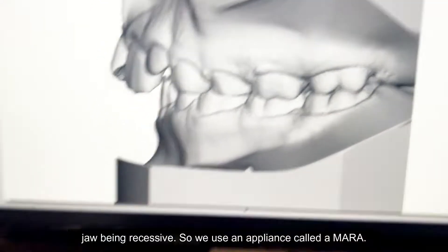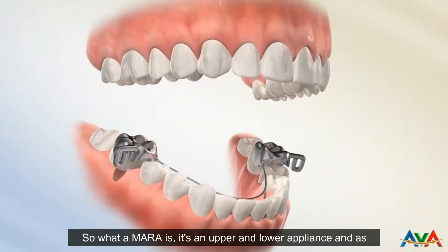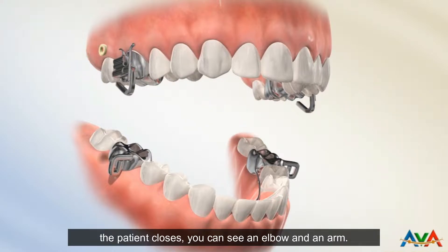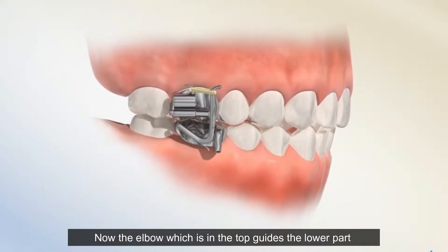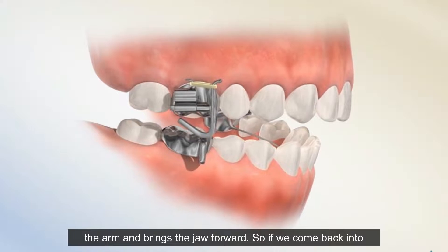We use an appliance called a MARA. The MARA is an upper and lower appliance, and as the patient closes, you can see an elbow and an arm. The elbow, which is in the top, guides the lower part of the arm and brings the jaw forward.